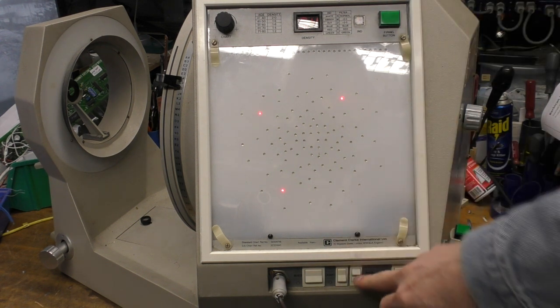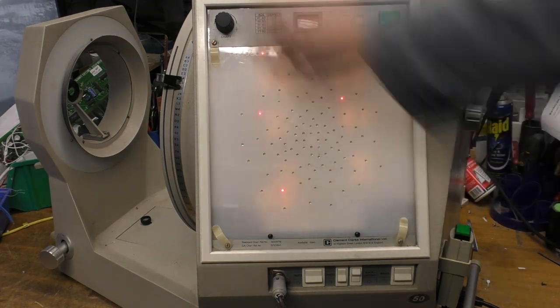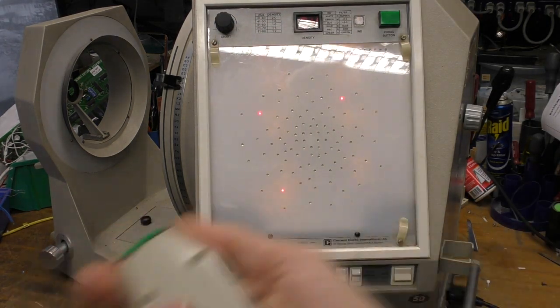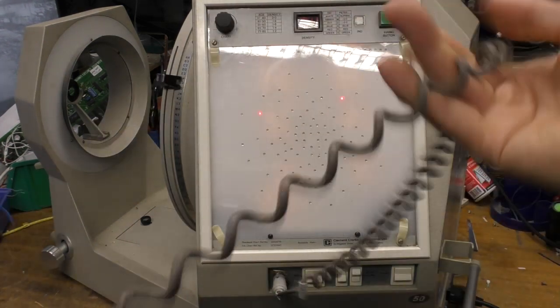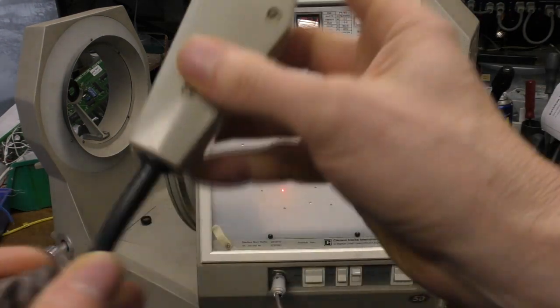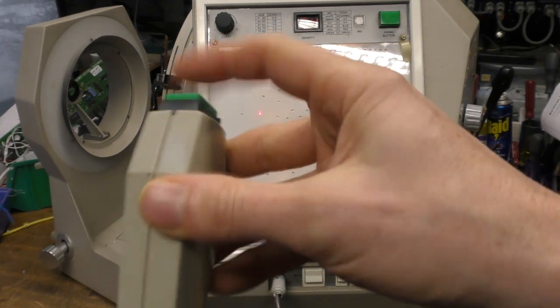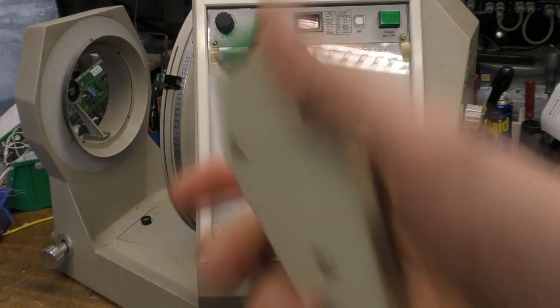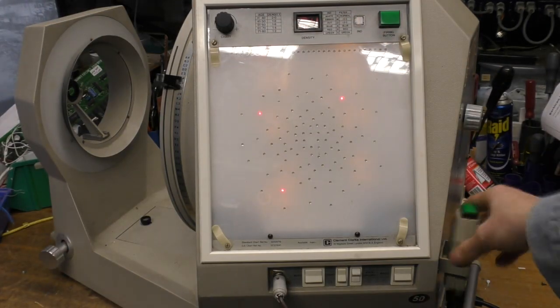There's a switch for illumination of this back-to-back light, this chart. There's also a handheld button, so you can press it. I think this curly cable's fractured because this lead's actually open circuit. I checked it, but obviously there's a remote one so that the person doing the test can sit beside the patient and fire it off remotely.